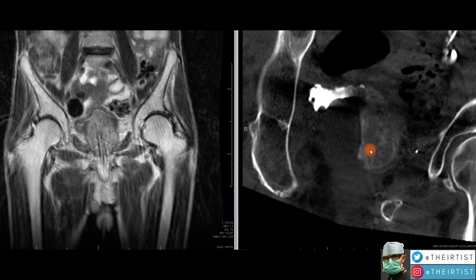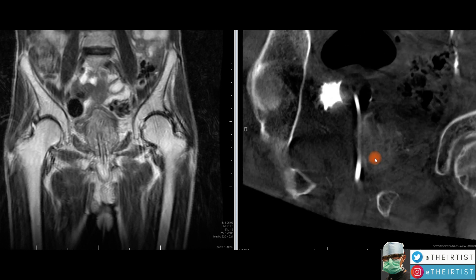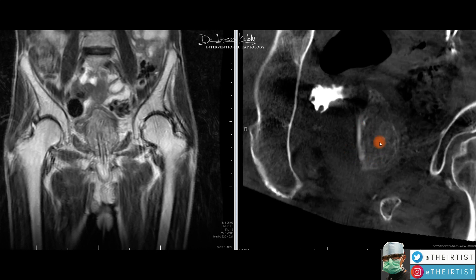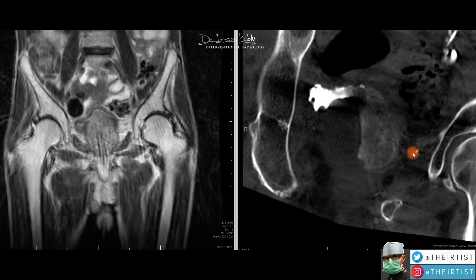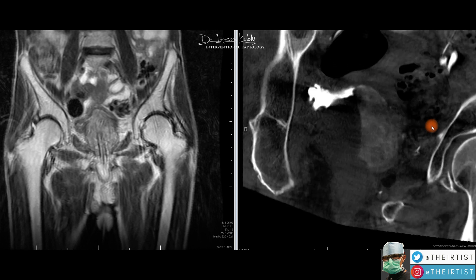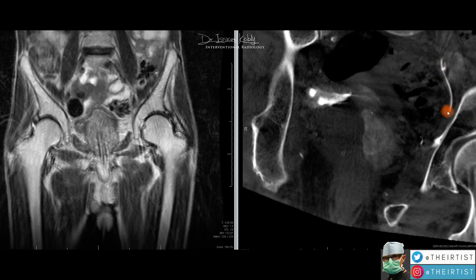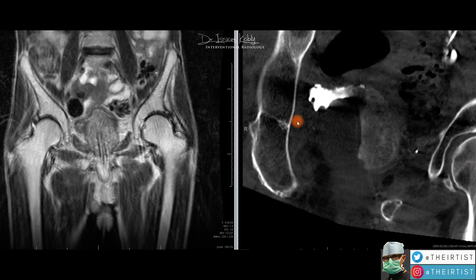This is how the prostate artery looks during embolization, and these are the cone beam CT images we take just before embolization to confirm we are indeed in the prostate gland. In this frontal view, corresponding to the MRI orientation, what we see in white is the left lobe of the prostate enhancing. The tip of the micro-catheter is here, meaning we navigated as close as possible to the prostate. The right lobe is not enhancing — it does not take the dye because it is fed by a different artery, the right prostatic artery.